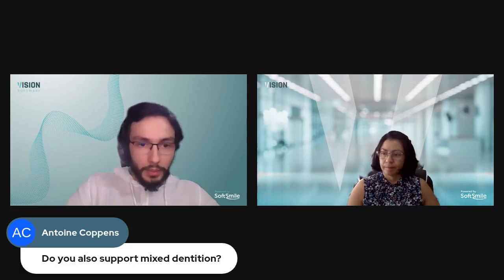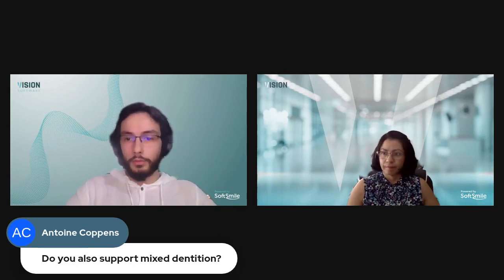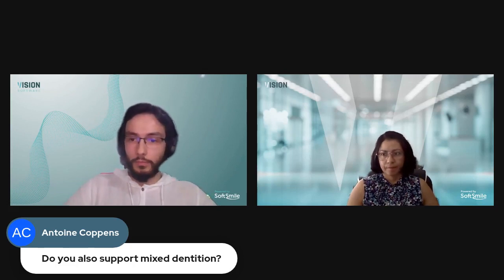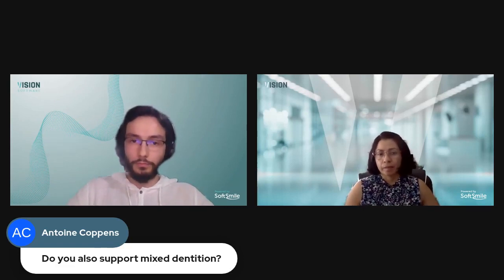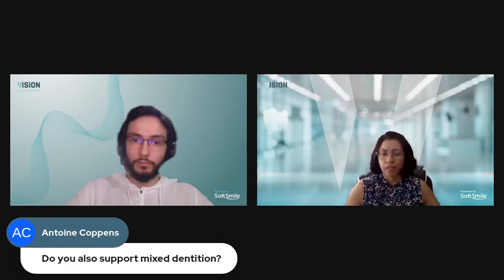Do also support mixed dentition. Maria, maybe you can comment there. Currently in our charting, we can have different charts or ways of identifying the teeth, but we currently do not support children's dentition and identifying those in the charting, but I'm sure it's coming. It's coming very soon, indeed.